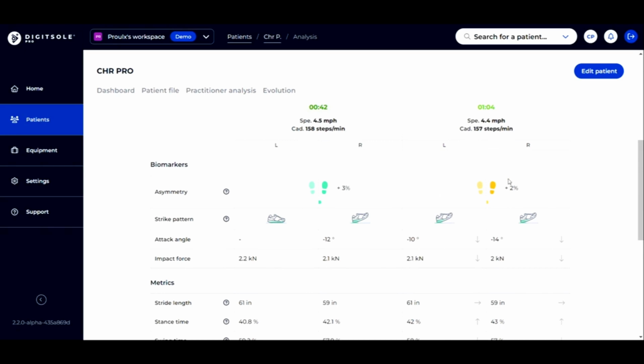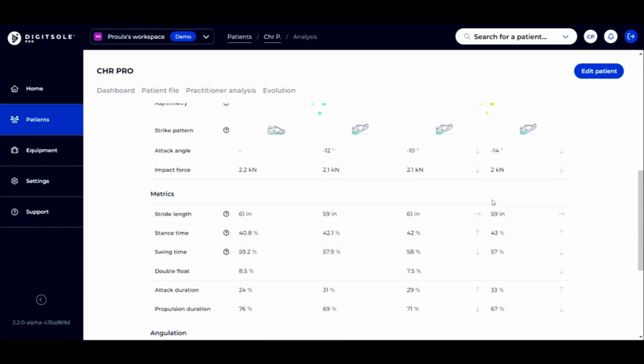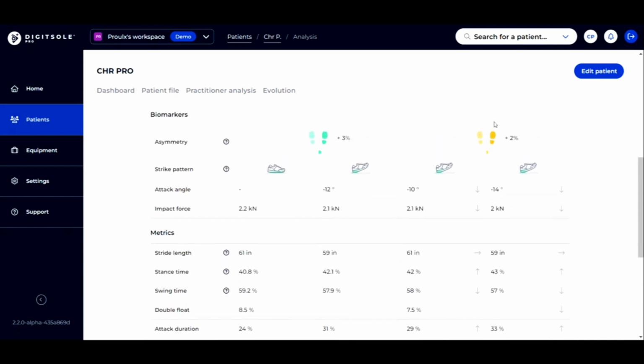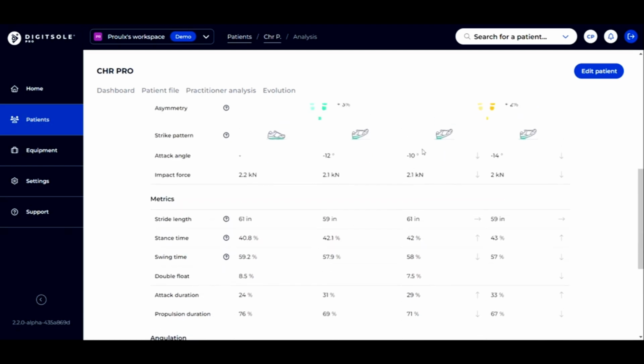So we start to see some potential changes or differences. And I will say that that's just a miscoloration because I'm using a different system at the moment. But so we start to see, oh, looky here. Now the person was actually heel striking more normal.